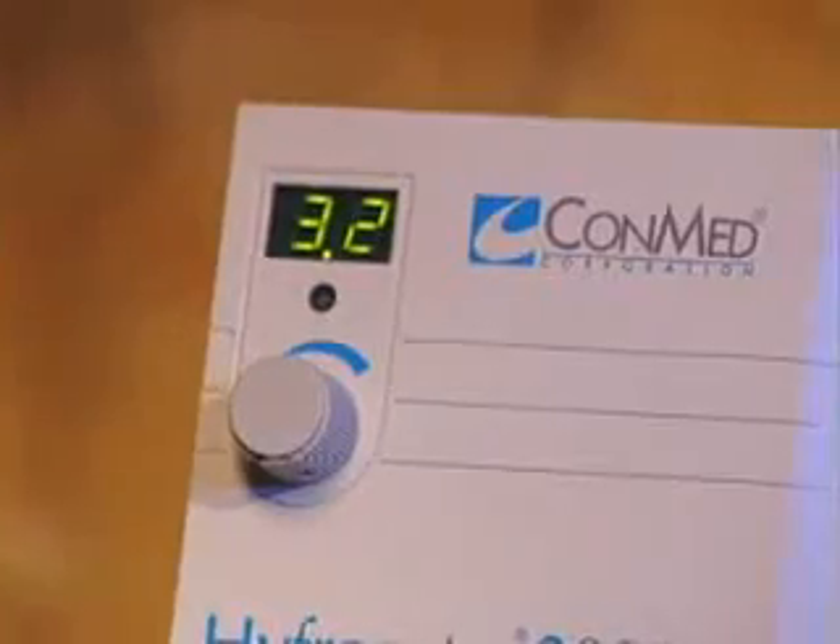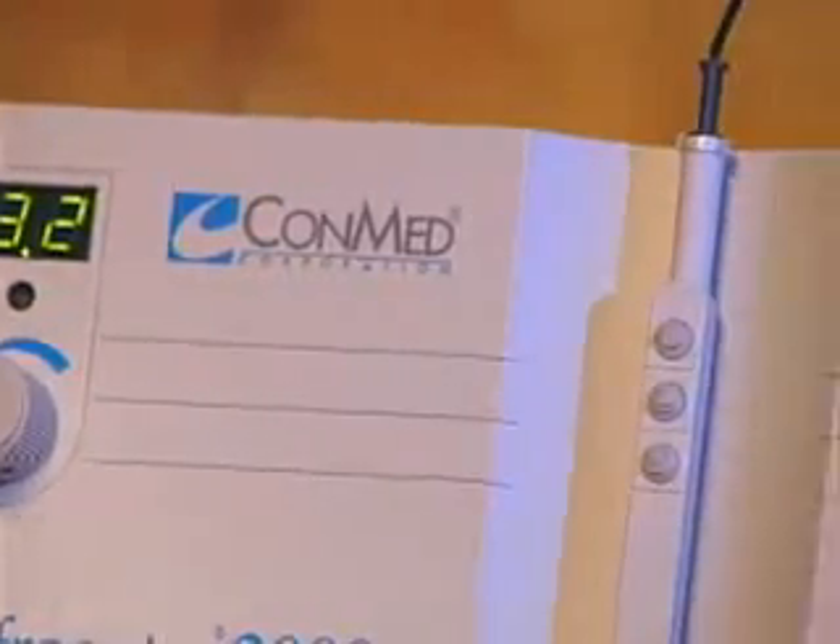Minute power changes are achieved through finite one-tenth of a watt power increments for more control and uniformity in low-power electrosurgical procedures. In just ten brief minutes, this videotape will cover the contents of this box, special features of the Conmed Hyfercator 2000, a brief demonstration on setup and usage, and helpful procedure tips. For more detailed instructions, please refer to your operator's manual. Let's get started.